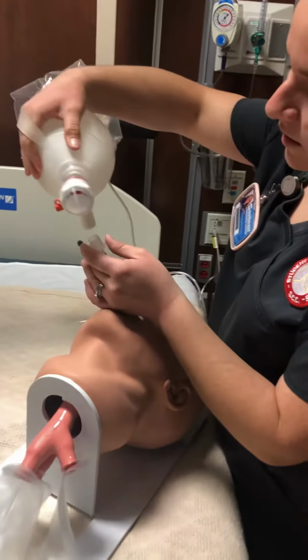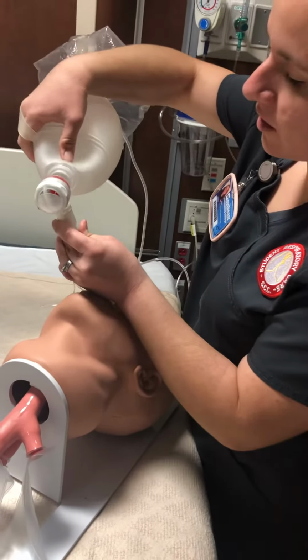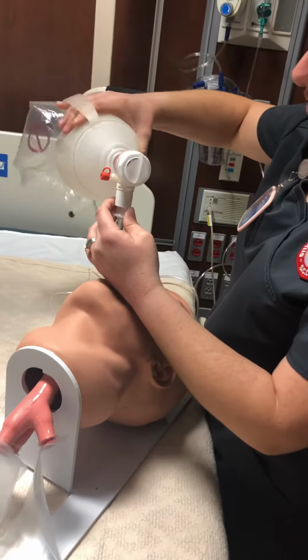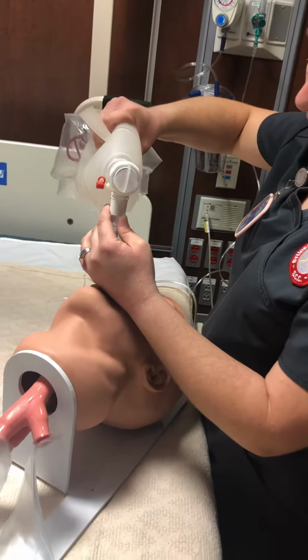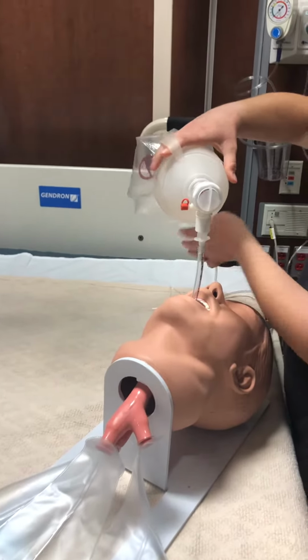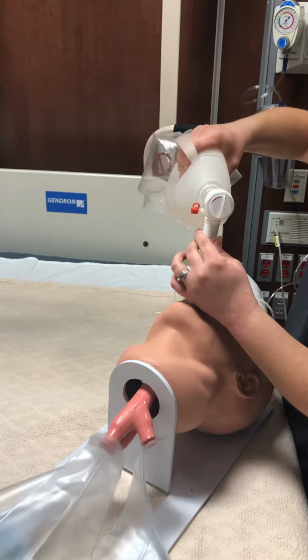So when I go, if there's a ventilator, I take that off, and then I apply this, and I would do 12 to 20 breaths for the patient. And I always make sure this bag re-inflates every time I do it.